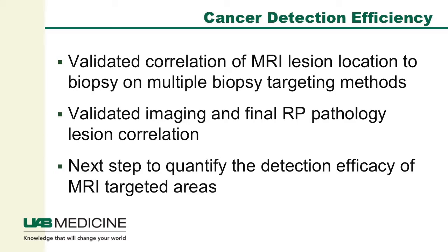And what you'll see is one of the things that I think is so great about how this technology was developed: it was developed as a true research collaboration between the National Cancer Institute as well as the Philips Corporation, which is the platform that we use, and there are others commercially available. But we really did our homework on this, is that the initial technology was developed. We first made sure that we could correlate what we're seeing on the biopsy with what we see at final pathology, and the correlation was 95% or higher, and that has been validated in other studies as well, of what the MRI says is a lesion is what we see at final path.